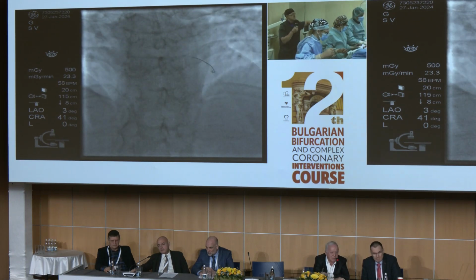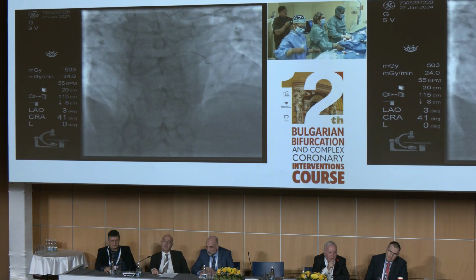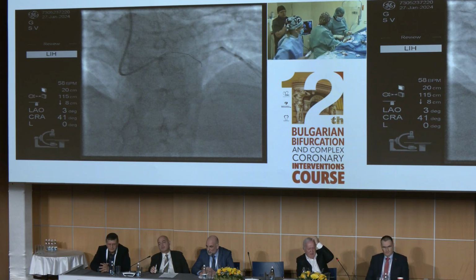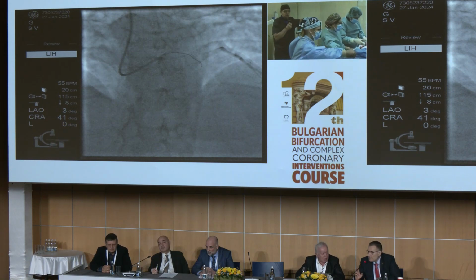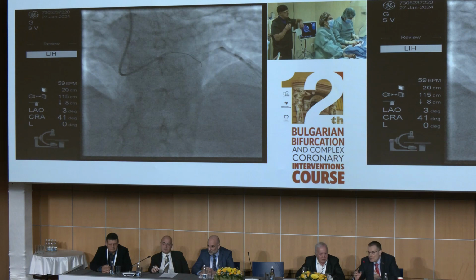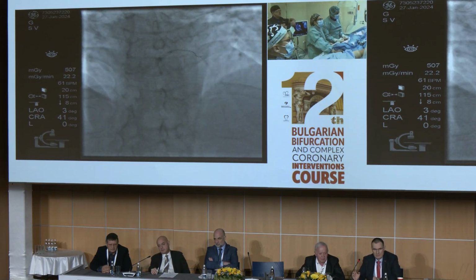my comment, because I said I would explain how to do it without IVUS, is that we will have malapposition of the proximal part, the POT, and the distal part will be well deployed, so no problem for the distal part. What about making an IVUS now, and after that completing it with a non-compliant balloon? I bet that in the proximal part the stent is not fully apposed, and there are at least zones of malapposition. We can still use a 4 millimeter semi-compliant balloon.